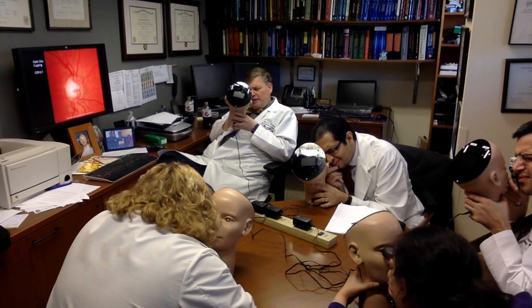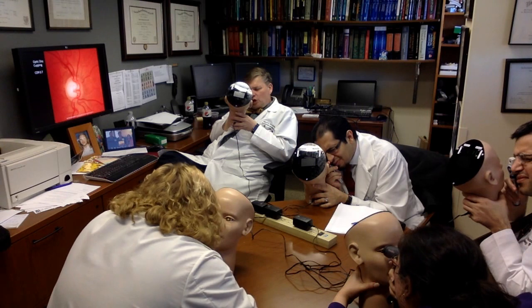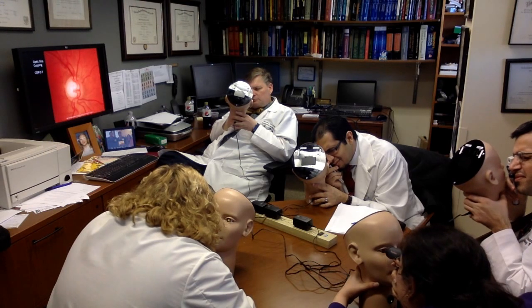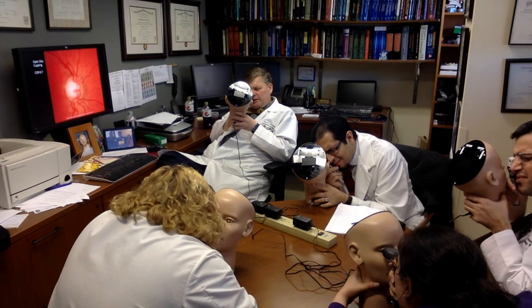Do you agree the veins are very tortuous? Indeed. Absolutely. The veins are engorged and very tortuous. What do you think about the size of the optic cup? It's kind of been obliterated. It's kind of like filled in.